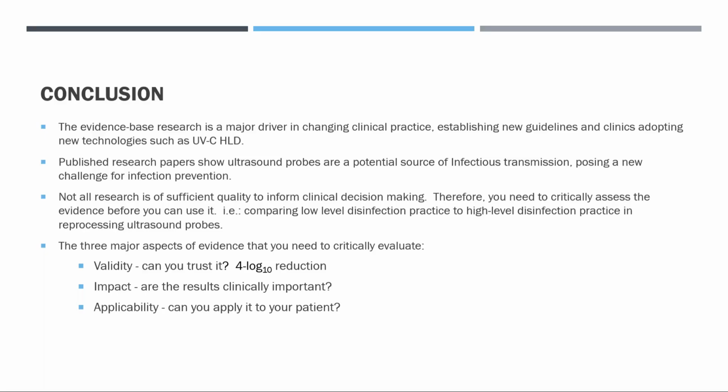Comparing low-level disinfection practice to high-level disinfection process in reprocessing ultrasound probes, of course, was the subject of our talk. And I've shown you the evidence as well as the guidelines, which are certainly appropriate and provide a solid rationale for why high-level disinfection should be used over low-level disinfection. Ultimately, it all comes down to this: high-level disinfection ensures patient safety, and certainly use of the ultraviolet C device makes things easier, as well as protecting your healthcare personnel.